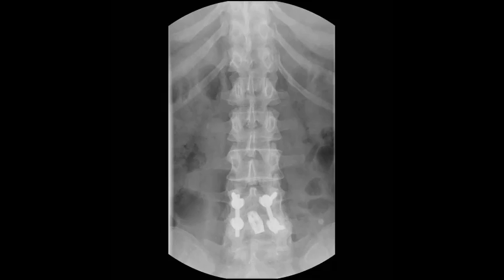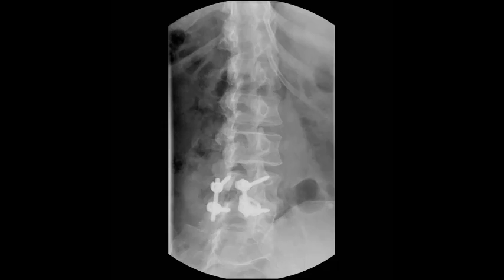You'll notice the patient has 5 non-rib-bearing lumbar vertebral bodies with hardware at L4, L5. If possible, I avoid sticking at the surgerized levels. The next shot we'll go into is with the patient obliqued. For a fixed II, positioning the patient is key.